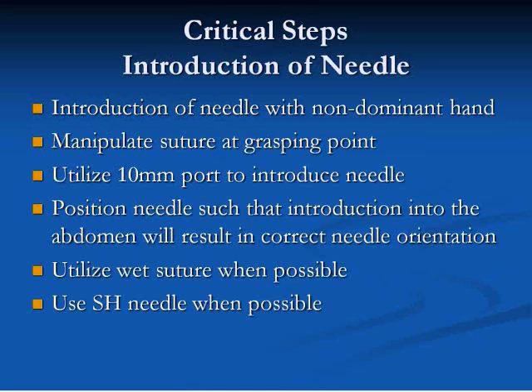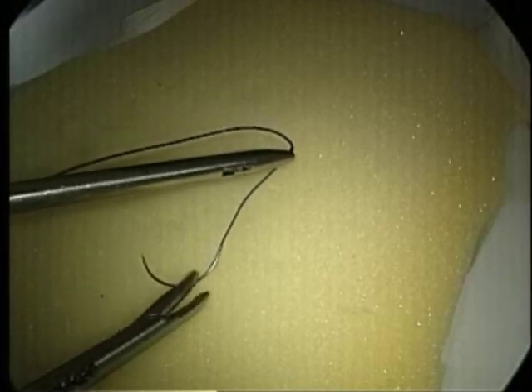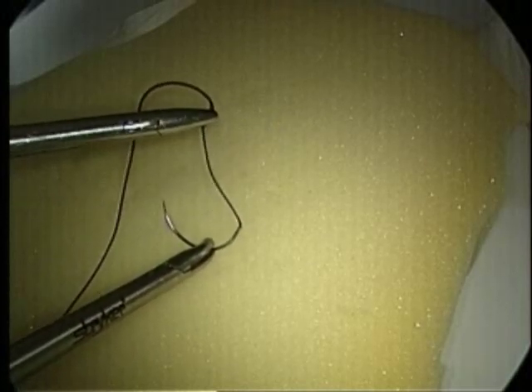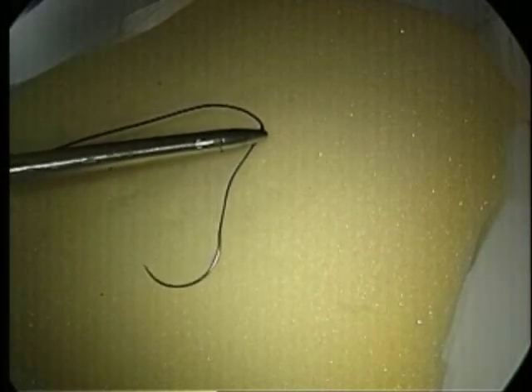In the first step, the needle is introduced into the abdomen. The needle should be introduced with the non-dominant hand. The needle is introduced by grasping the suture, not the needle. The suture is grasped approximately 3 centimeters behind the swedge of the needle. Grasping the suture too close to the swedge hinders rotation of the needle to the correct orientation if needed. The suture should be picked up from a neutral position with the needle pointed in the direction you are planning to sew.